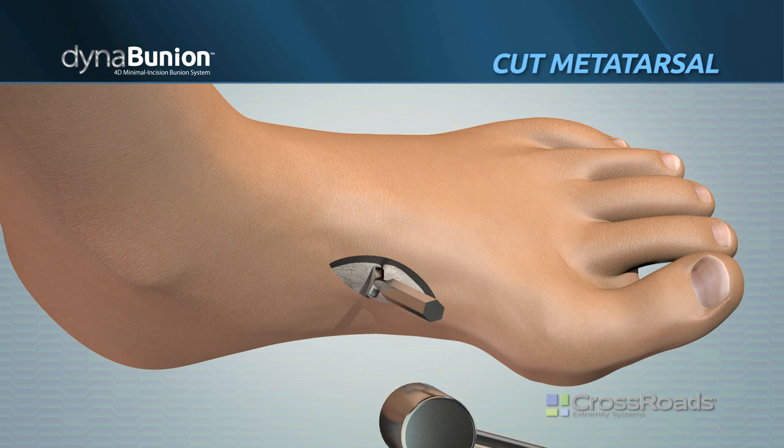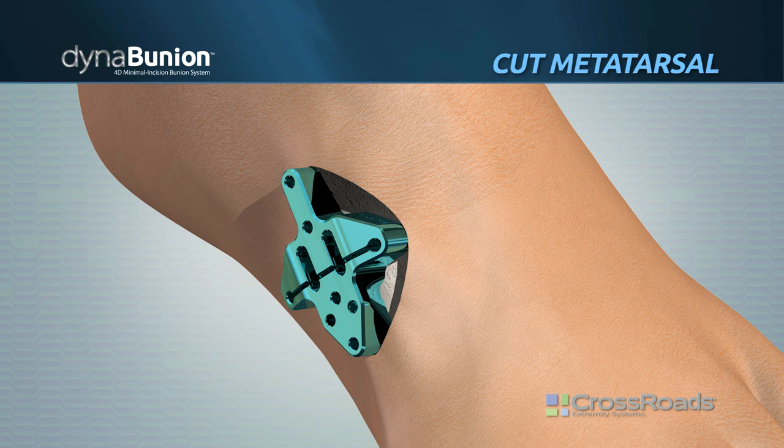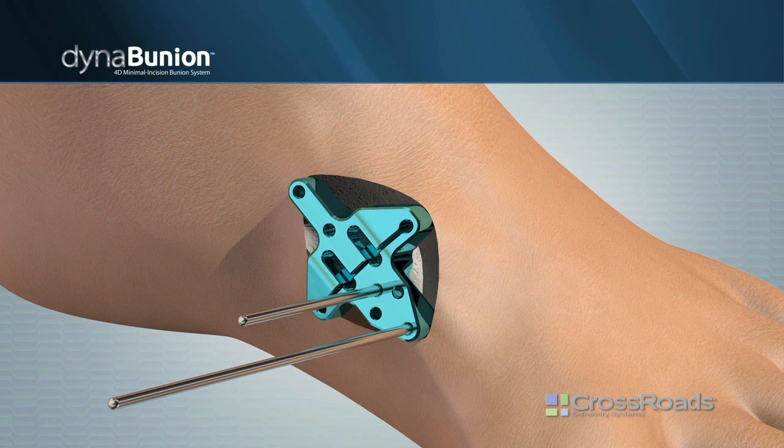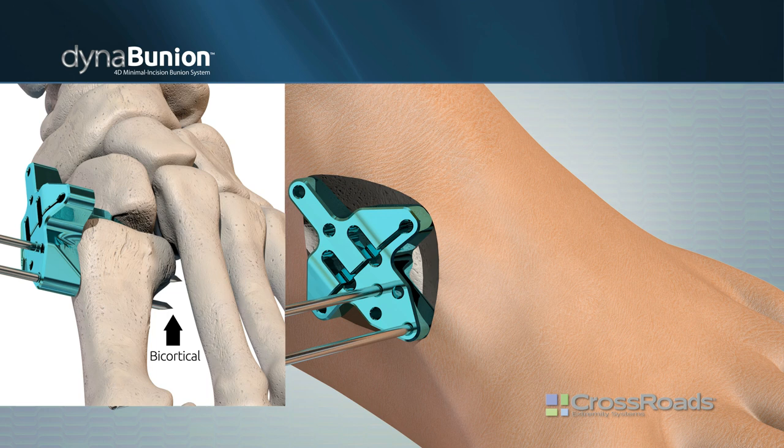Place the paddle of the cut guide into the joint with the cutting side facing the metatarsal. Place the short 2 mm wire into the second most distal hole. Place a long 2 mm wire into the most distal hole. Ensure that both wires are bicortical, but not into the second metatarsal.